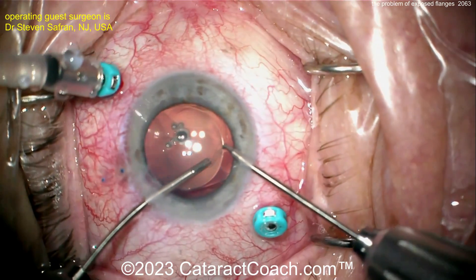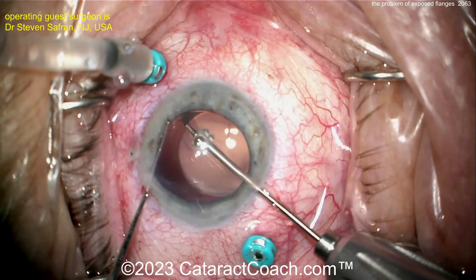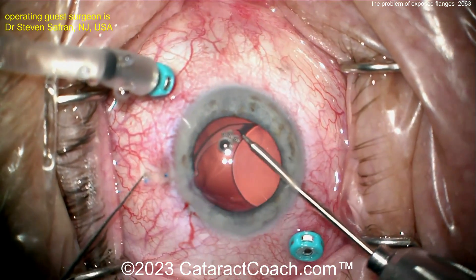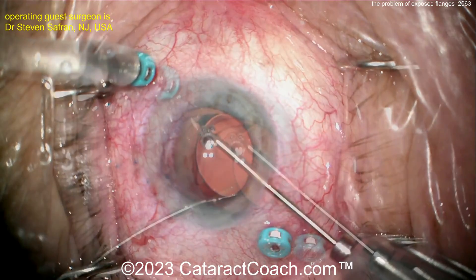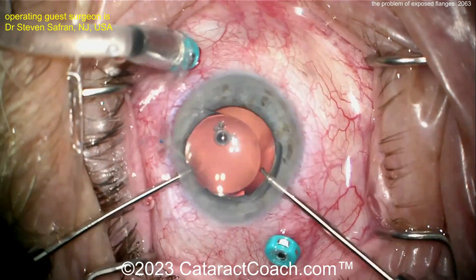Now the proline flanges — the problem you have, especially in this case, is you can see they're at 90 degrees, perpendicular to the sclera. So just a simple poke in. And then if you see these blue nubbins under the conjunctiva, well that's going to be an issue. They're going to erode. It's not going to last.